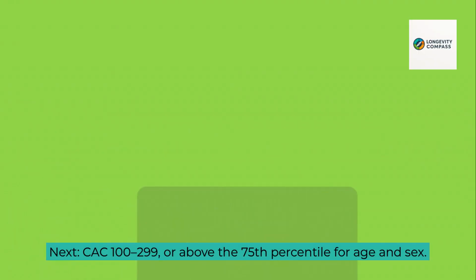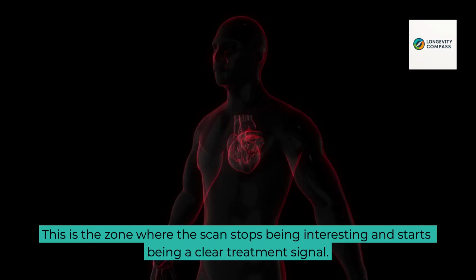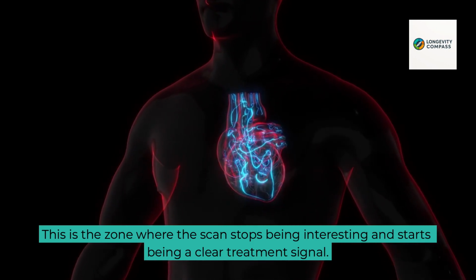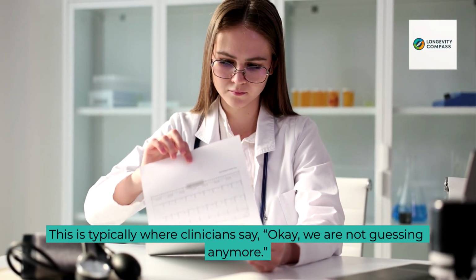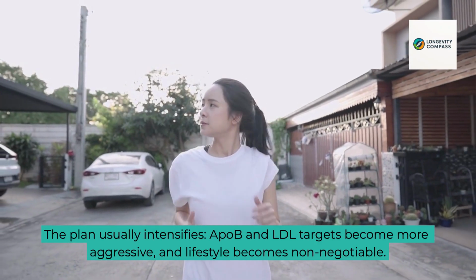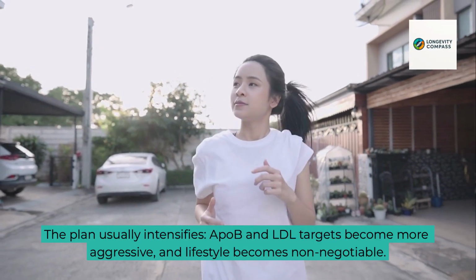Next, CAC 100 to 299, or above the 75th percentile for age and sex. This is the zone where the scan stops being interesting and starts being a clear treatment signal. This is typically where clinicians say, okay, we are not guessing anymore. The plan usually intensifies, ApoB and LDL targets become more aggressive, and lifestyle becomes non-negotiable.